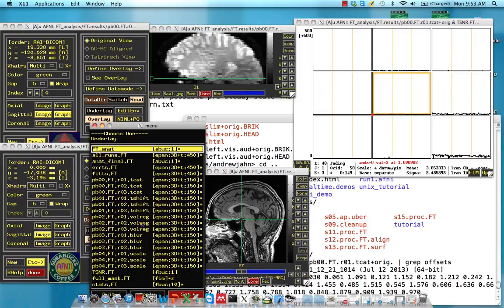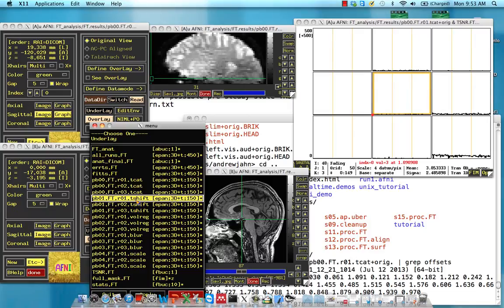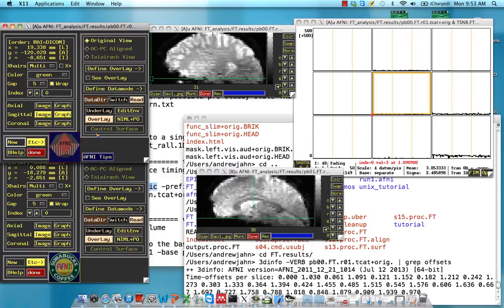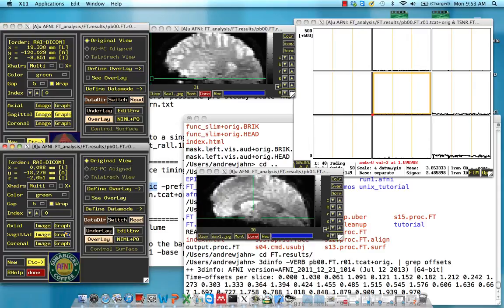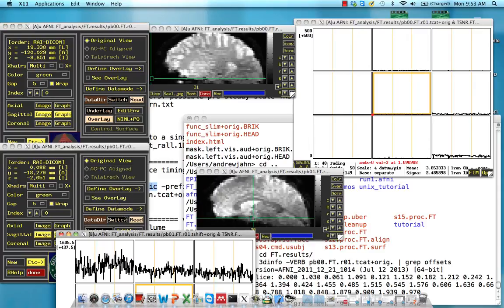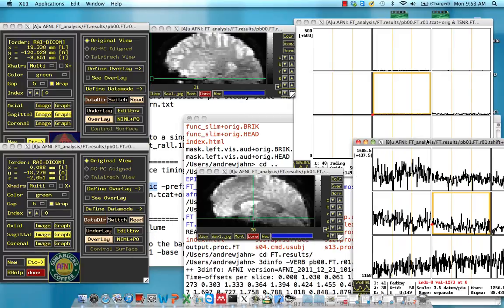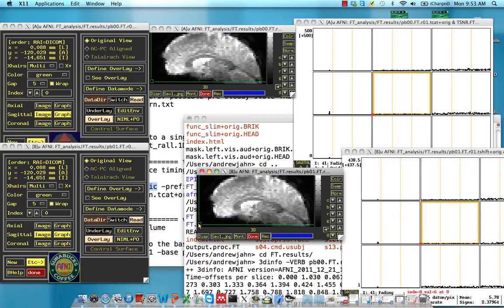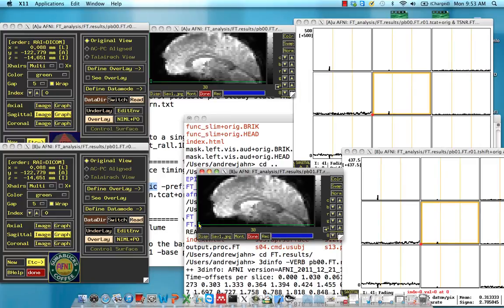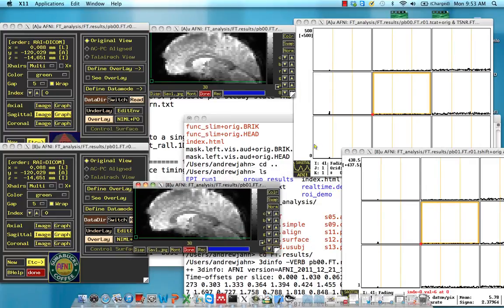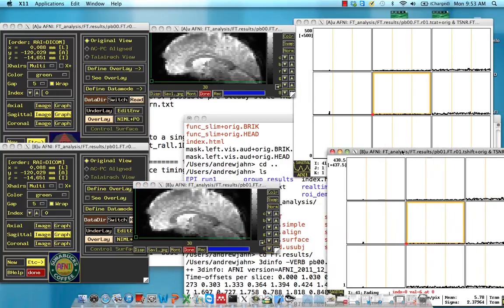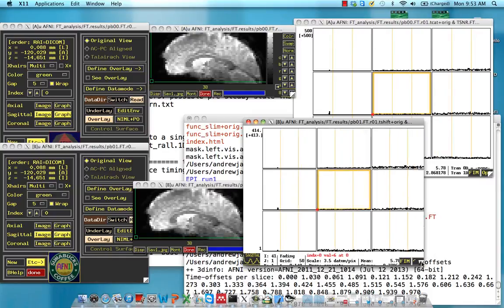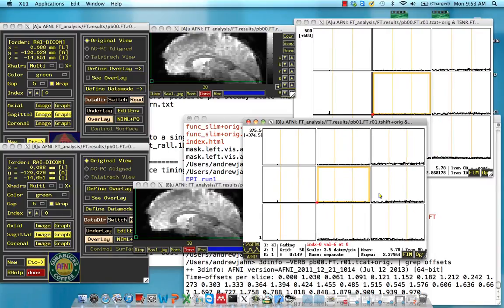For underlay, we are going to do the T shift, run one. So same run, it's just had this correction applied. Open a graph window. Let's go to the same location, just in the very bottom left. And now, I'm going to resize these just so you can see what's going on.